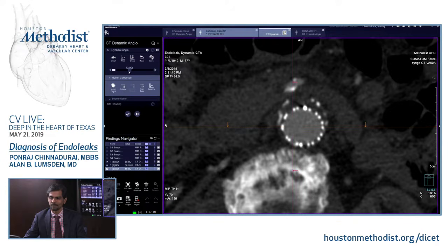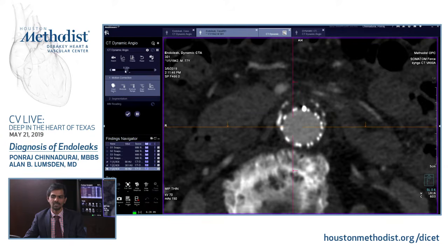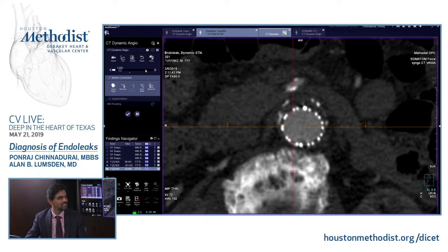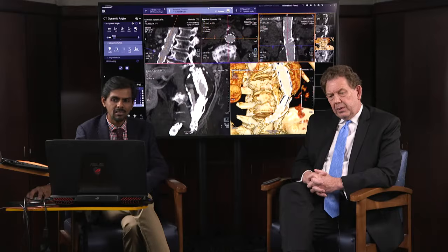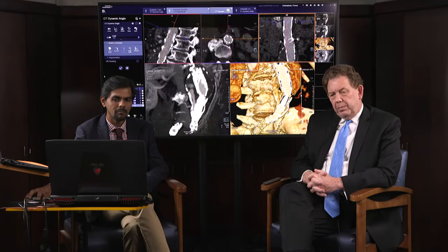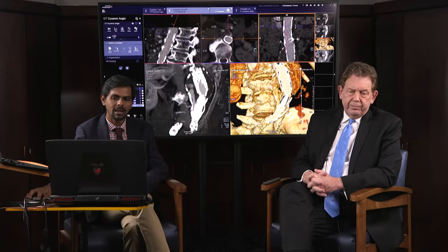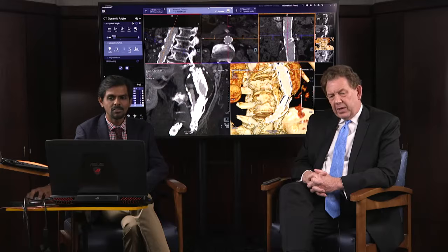So you're going to give me the time course of what happens right at that spot. Exactly. So this, number 1, for sure rules out Type 1 endoleak. Don't see any flow there. In supine position, it doesn't look very well opposed, but it's clearly not getting down. At least flow isn't occurring down in the aneurysm sac. Okay. And since we also have a long seal zone, it's very well opposed here, and it's probably not well at the top, but you have enough seal zone along the neck of the aneurysm. All right, I'll buy that.